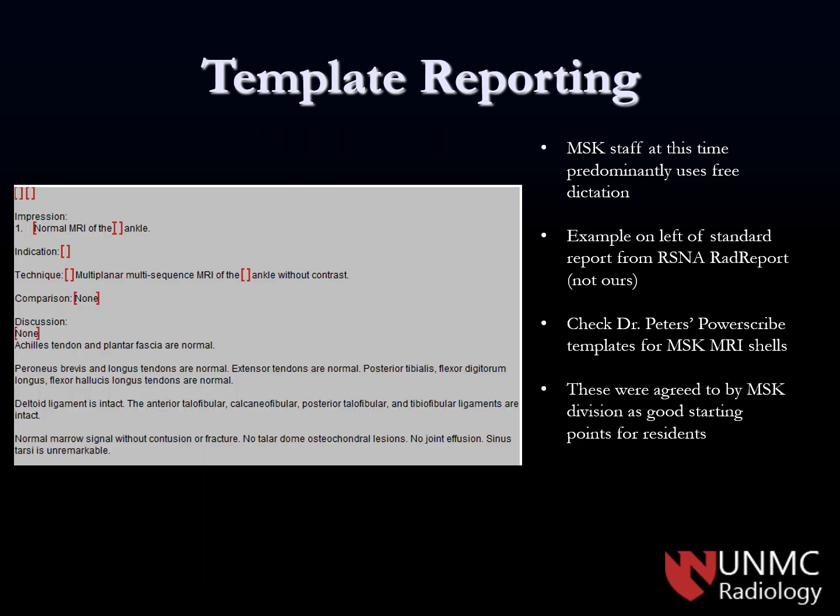We did come together as an MSK group and make some templates, not for every joint, but for some joints, that you can find under Dr. Peters, who led that effort. And he does have one for ankle, which is nice, much shorter and more concise than that template report we just had before. But this would be a great start for a template of normal MRI reporting if you'd like to use it.